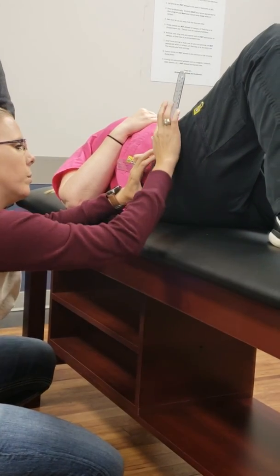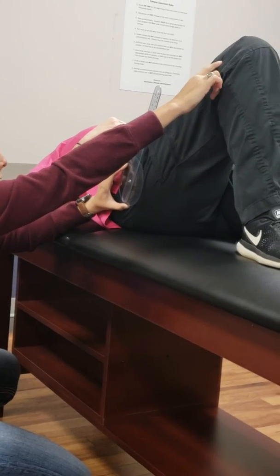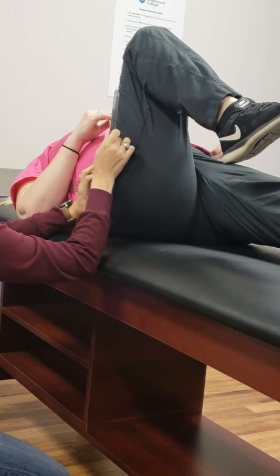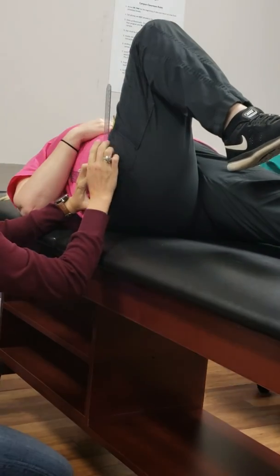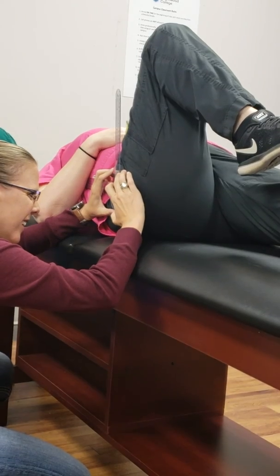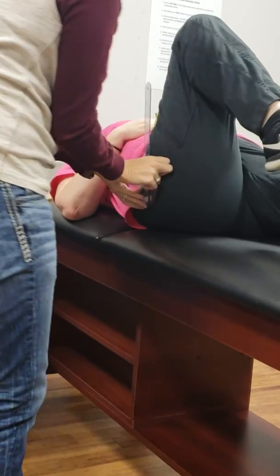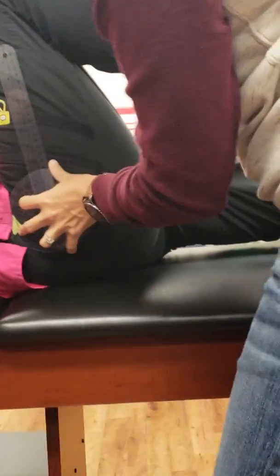And then your movable is going to be the midline of the femur all the way to the lateral epicondyle of the femur, and you're going to have the patient bend their hip as far as they can. You're going to keep this where it's supposed to be. We went from 0 to 97. This is what's going to happen with your patients too. So that's active; if you wanted to do passive, we could push more, and then we can make sure that it's lined up. And now we can tell you that we went to 101.